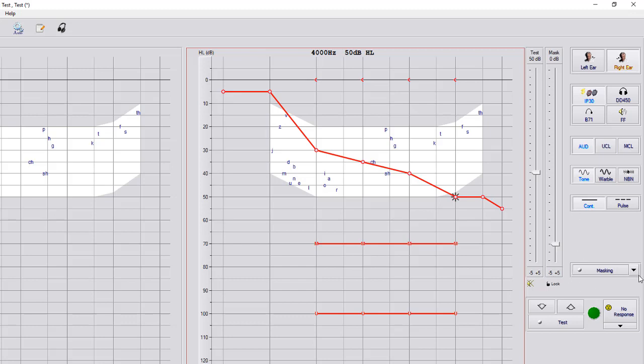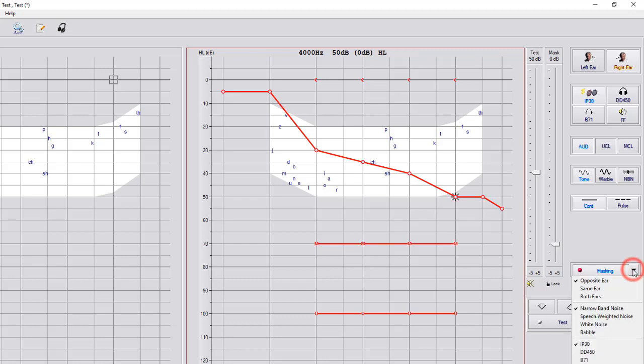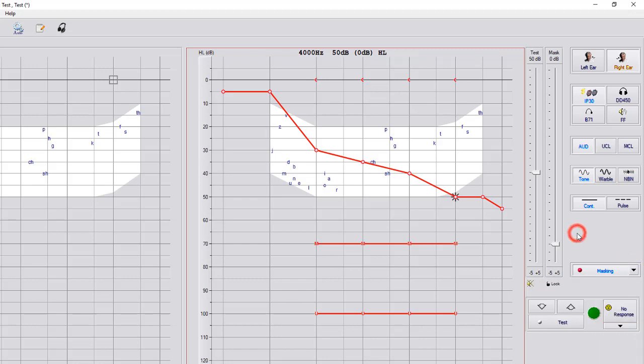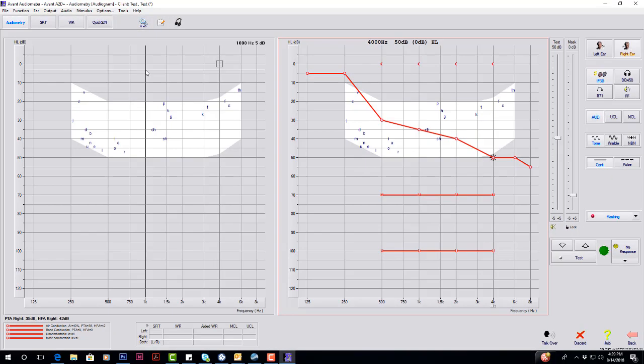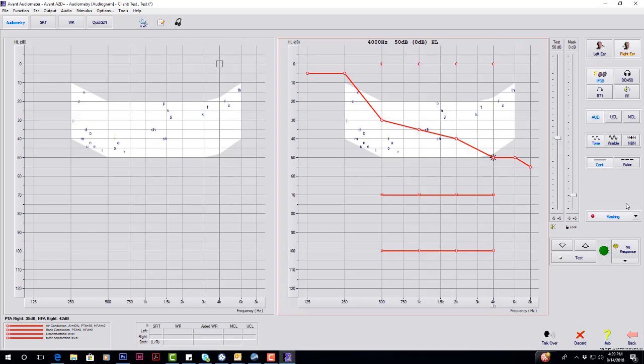Below here, we have your masking. Once you select masking, it's going to turn aqua blue or the little red light will come on. In the dropdown, it always defaults to opposite ear, narrow band noise with an IP30. Right now, the right ear is selected, so the masking is being played in the left ear because it is opposite.